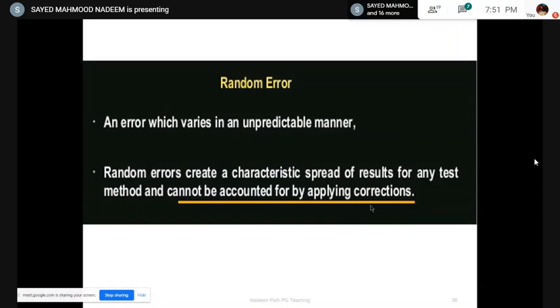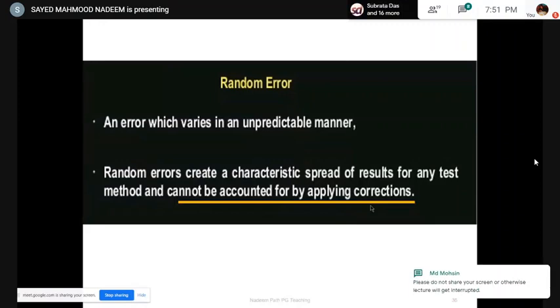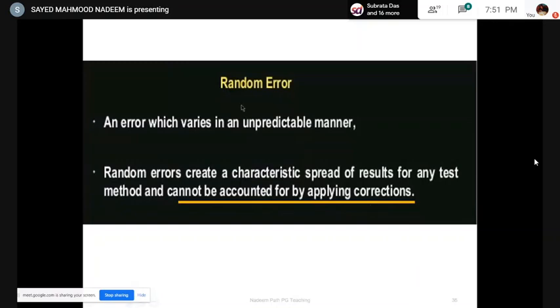You just rerun the same control again. Now this time it is within plus minus 1 SD. Now you have no explanation as to why at the very first go it gave you an error of 3 SD. This is called a random error, an unpredictable activity which you cannot exactly account for the reasons.